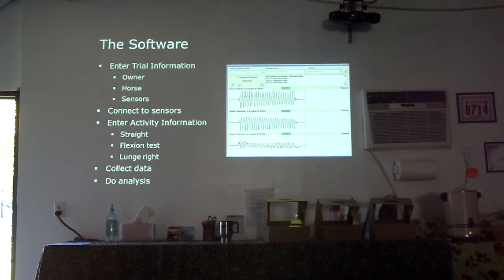Okay, so if the horse gets out of range, you just get the horse to come closer, because you don't have to worry about the sensors becoming asynchronous, which, by the way, would completely screw up the fault detection analysis if the sensors were not synchronous. But there are buffers on the sensors and a very accurate timestamp, so even if it's collected asynchronously, the computer will put it all back together synchronously and do a correct analysis. We've tested that in depth also.